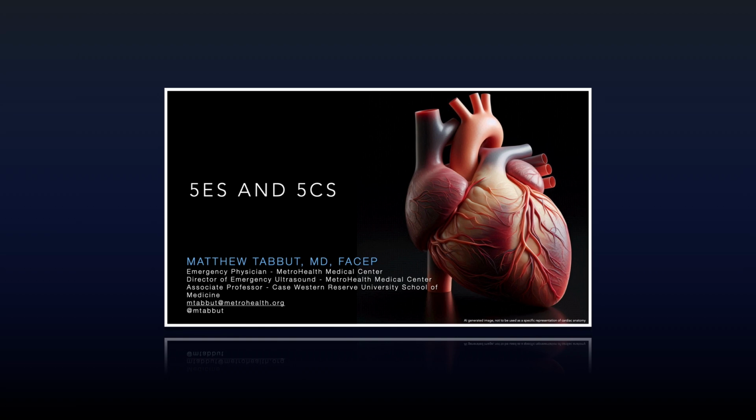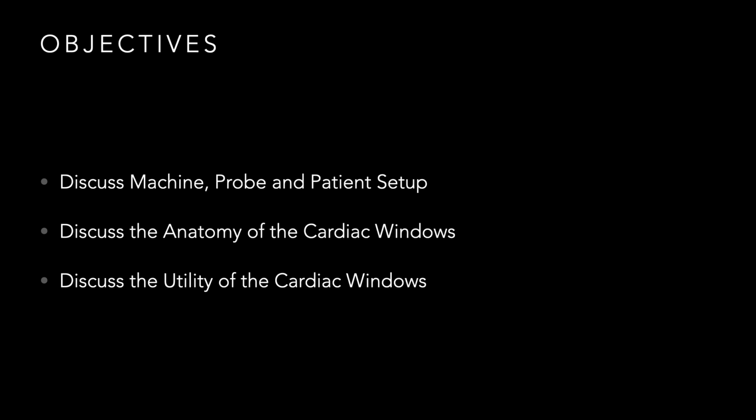As we put all these pieces together, these are the questions that we're going to answer as we think through our bedside echo. But we want to back up. We want to talk a little bit more about some basics today. With that being said, our objectives today are this. We're going to talk very briefly about machines, probes, patients, and how you even approach the room. What do you do when you bring the machine into the room and get started? Sometimes that's the hardest part: I just need to get to the bedside and start.